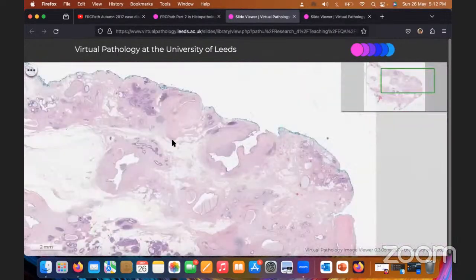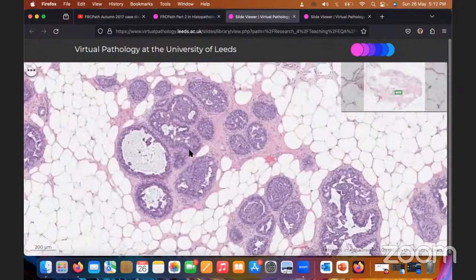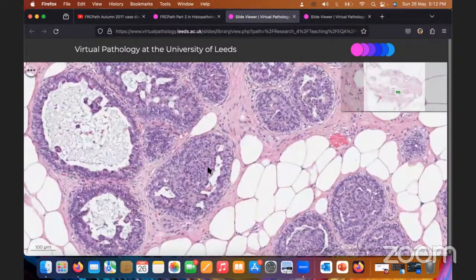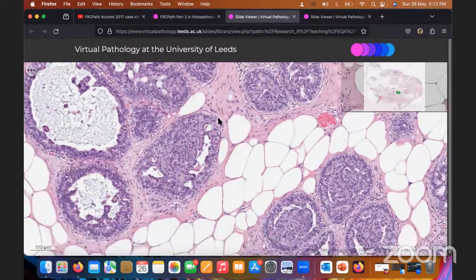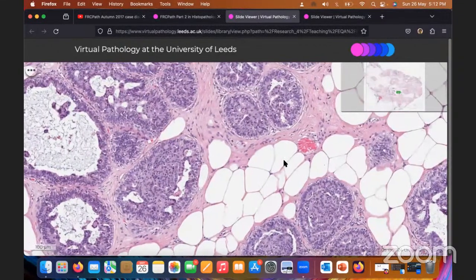And in the lobular unit, you can say that epithelial hyperplasia is seen. This is the epithelial hyperplasia. We can see the spaces which are mainly centered towards the periphery of the ductule, and they are kind of crescent shaped. They are parallel with the outline of the lobules. So this is a usual type hyperplasia.